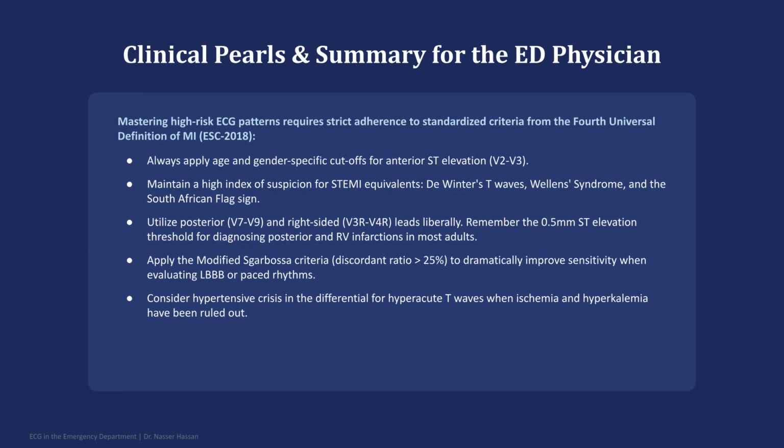In summary, mastering high-risk ECG patterns requires strict adherence to standardized criteria. Maintain high suspicion for STEMI equivalence, utilize additional leads liberally, and apply the modified Sgarbossa criteria when necessary. Your vigilance can ensure life-saving interventions for your patients.